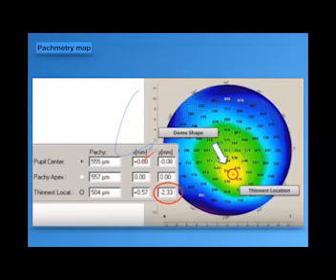So this patient is a candidate for OCT. The anterior segment OCT will measure the corneal thickness more precisely and accurately instead of the Pentacam, to get the real thickness of this cornea and the scar point. The OCT is more precise and more accurate. And so there is a new device now with both Pentacam and OCT to measure such situations. Okay.